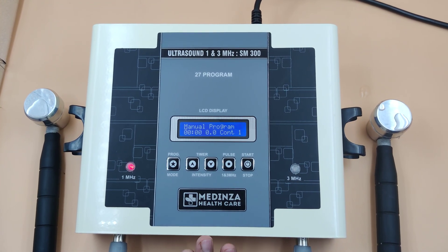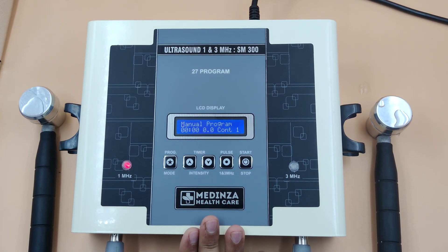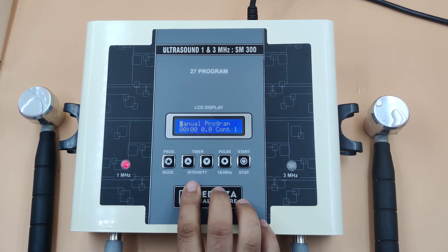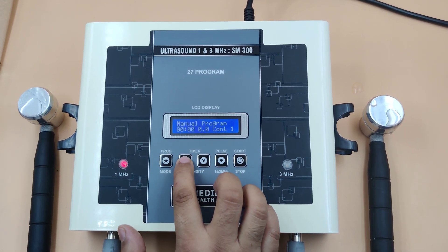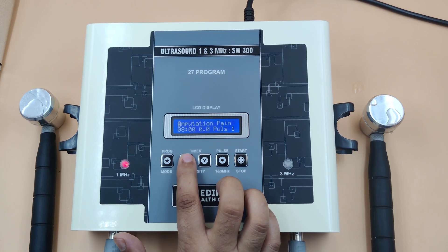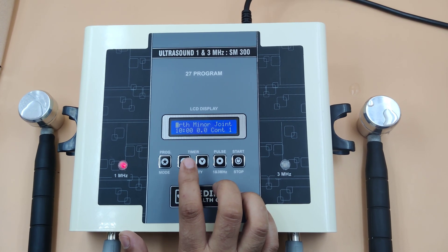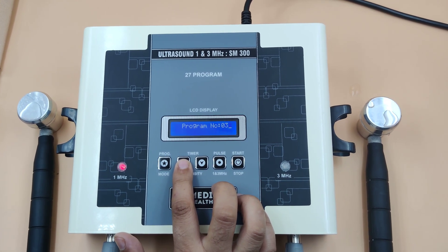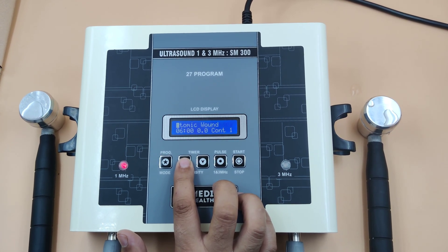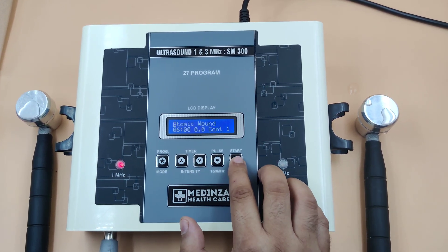Now I will show how to use the preset programs. Set the program using this button: manual program, program 1 and its name, program 2 and its name, program 3 and its name. Start the program.